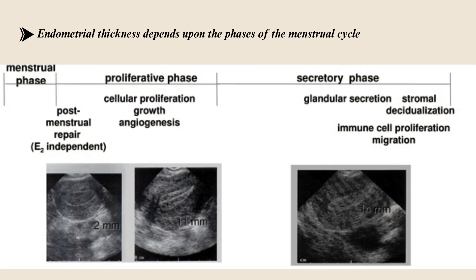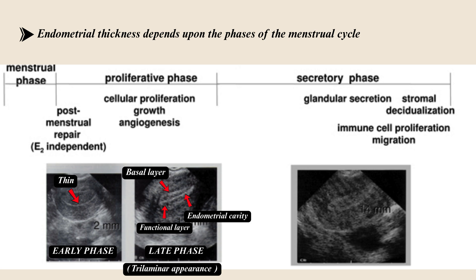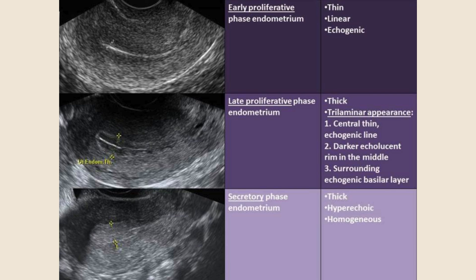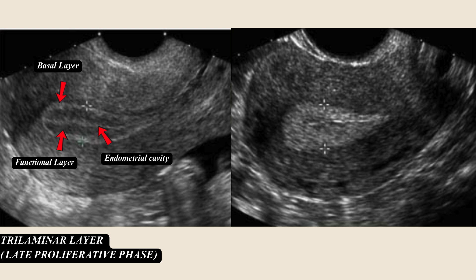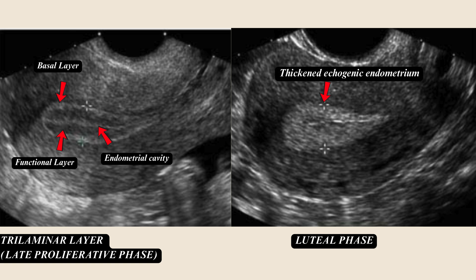Endometrial thickness depends upon the phase of the cycle. In the early proliferative phase, the endometrium is very thin. In the late proliferative phase or mid-cycle, we can see a trilaminar appearance of the endometrium showing the basal layer, the functional layer, and the endometrial cavity. In the secretory phase of the menstrual cycle, the endometrium becomes very echogenic. This image shows the same uterus — one side shows the trilaminar appearance indicating mid-cycle, and the other shows a thickened echogenic endometrium indicating the luteal phase.